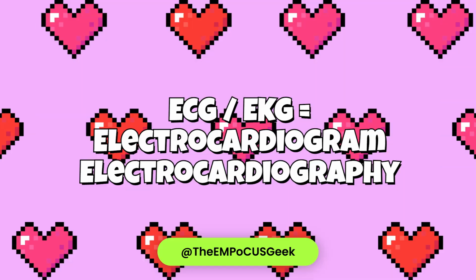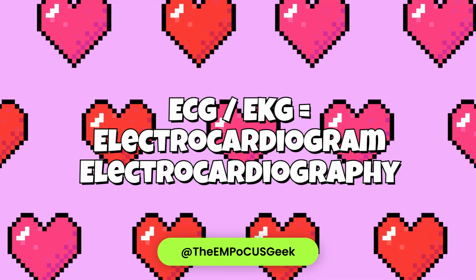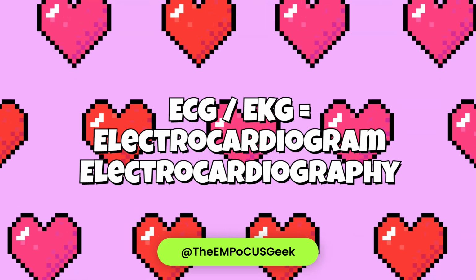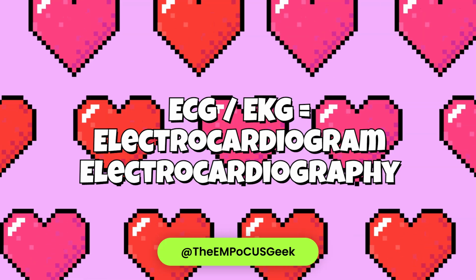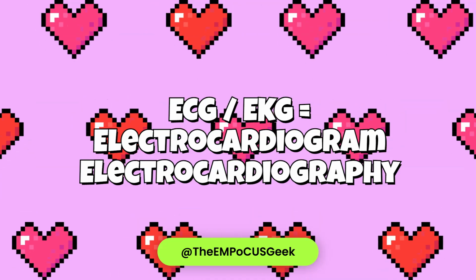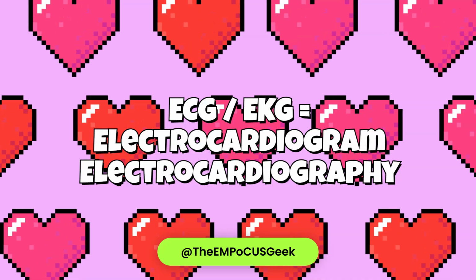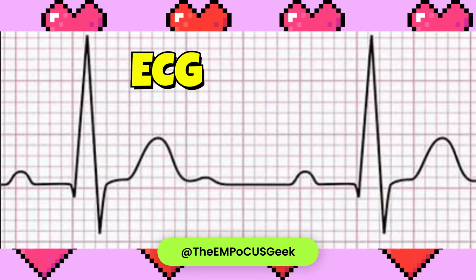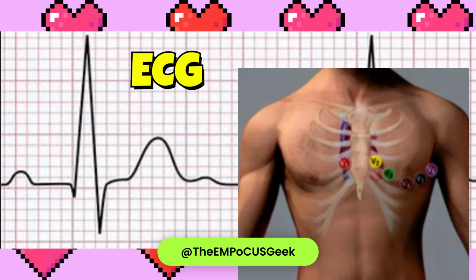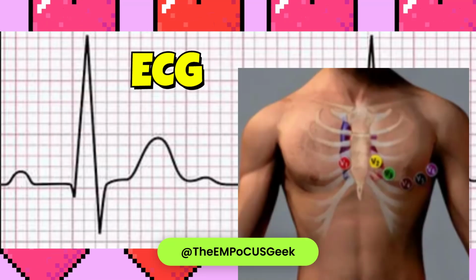All right, let's get back to ECGs. First, let's learn what an ECG is. ECG stands for electrocardiogram or electrocardiography. In some countries, it is also called EKG. An ECG is a test that records the heart's electrical activity using electrodes attached to the skin.